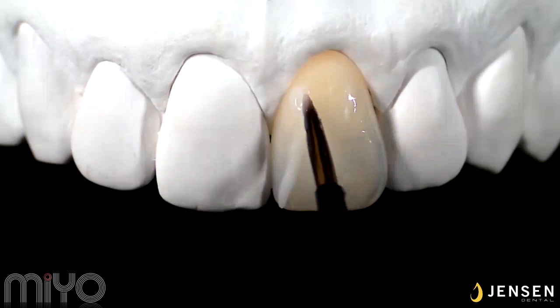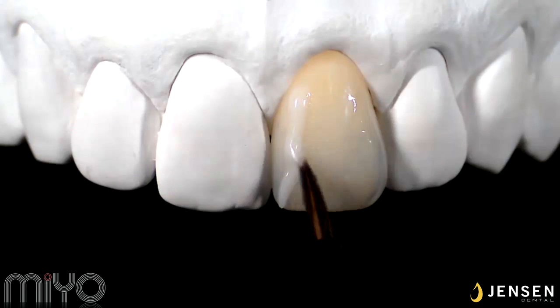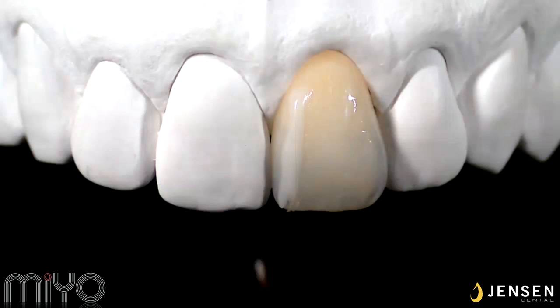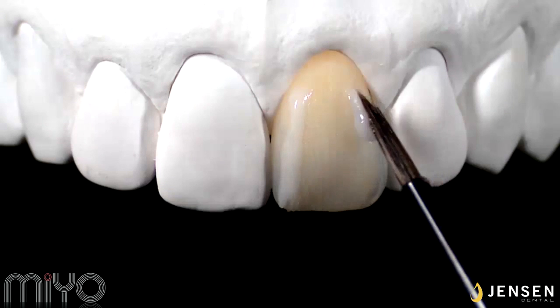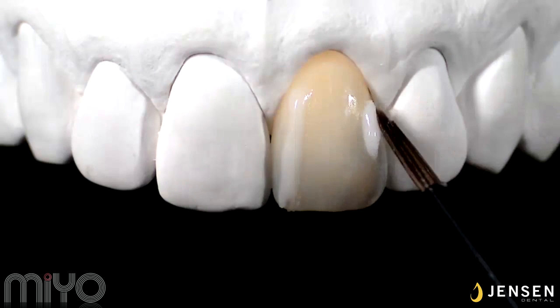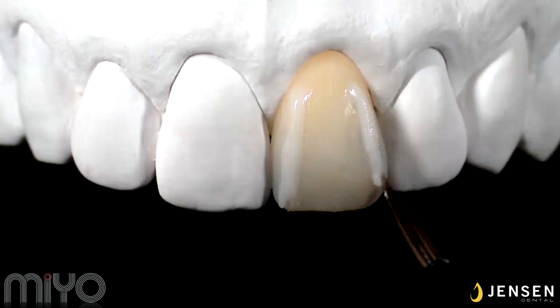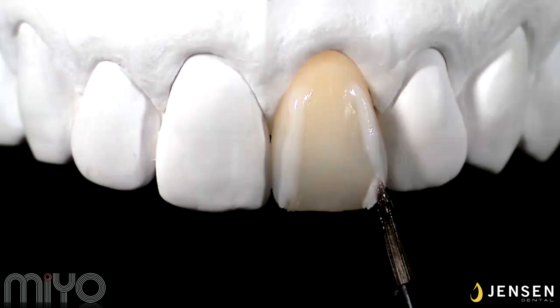Make sure you mix very well and flatten the material out on your palette to create a homogeneous mixture. This material is very new and very different from what we've been seeing so far. So I believe it's very important to apply correctly as introduced in this video. On the brighter side though, the learning curve is drastically cut down compared to a normal layering material.